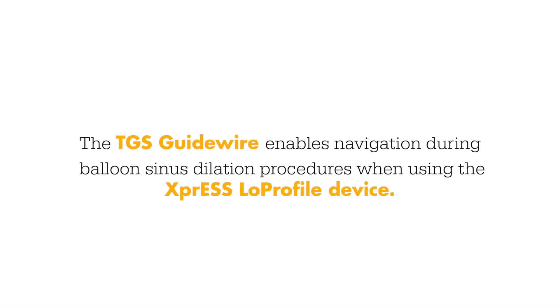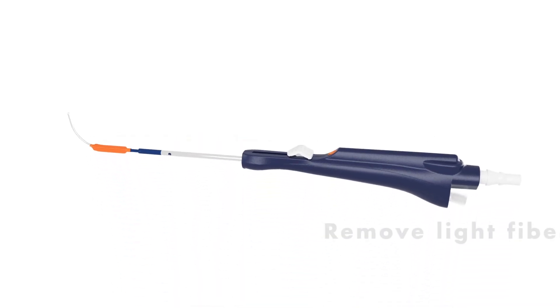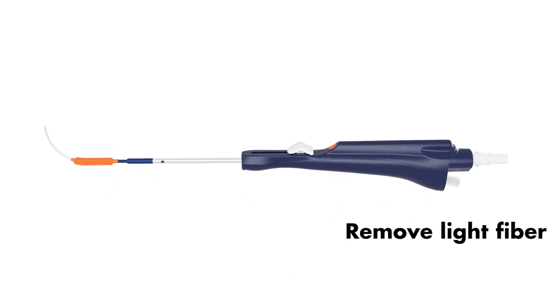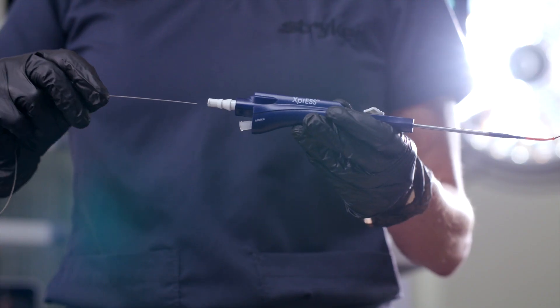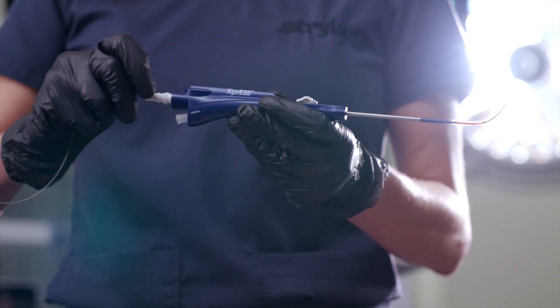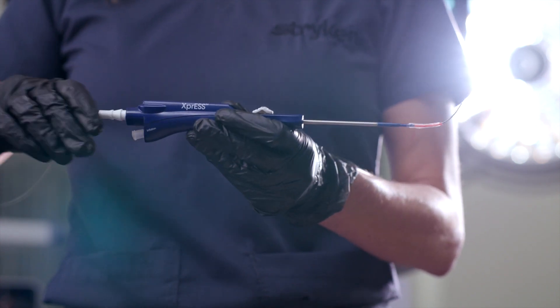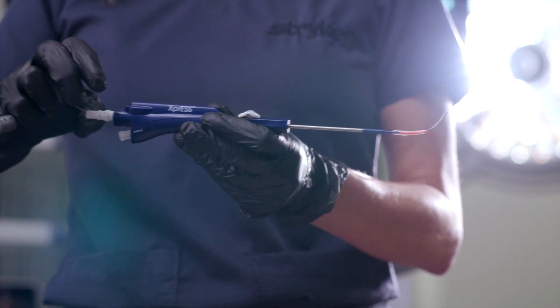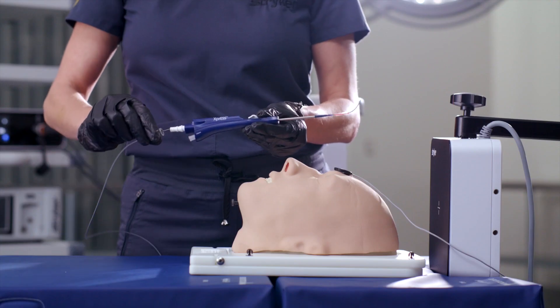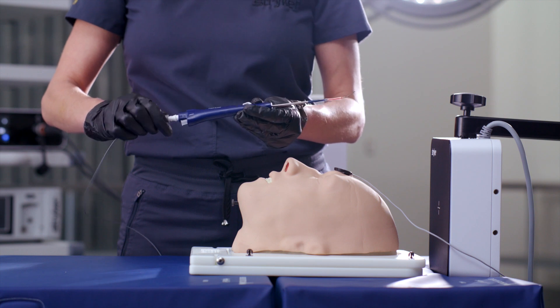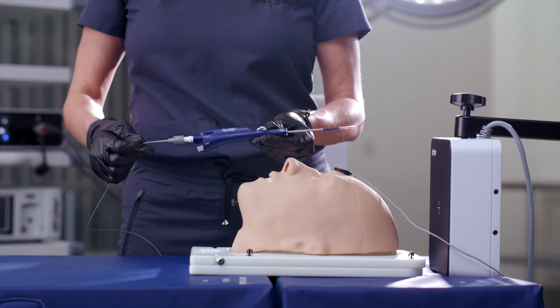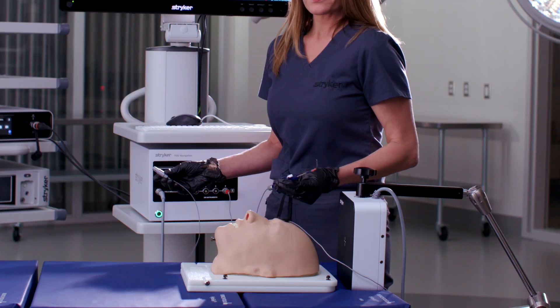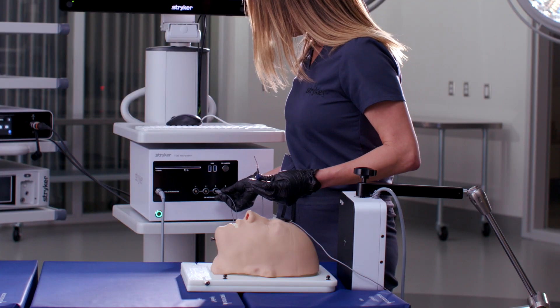The TGS guide wire enables navigation during balloon sinus dilation procedures when using the Express Low Profile device. To prepare the Express Low Profile for use with the TGS guide wire, first remove the light fiber. Next, insert the TGS guide wire into the working lumen of the Express device. Secure the guide wire bayonet connector to the lure fitting of the Express device, then connect the plug into the navigation system.